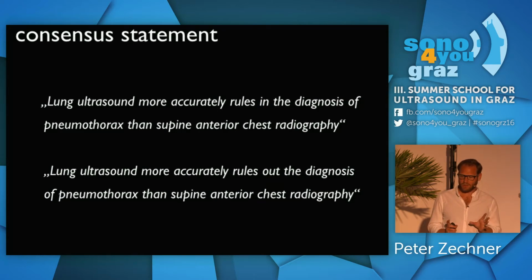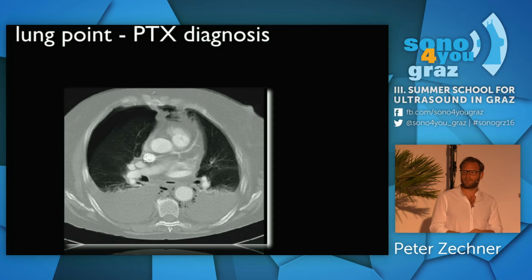But what do you think? Do we always have to find the lung point?